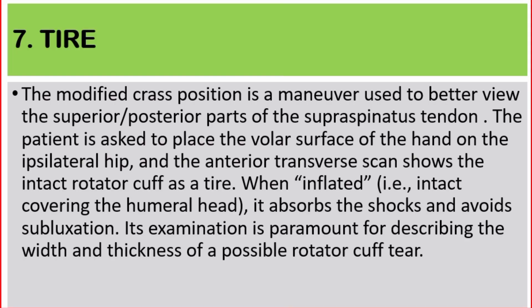Number seven: tire. The modified Crass position is a maneuver used to better view the superior and posterior parts of the supraspinatus tendon. The patient is asked to place the volar surface of the hand on the ipsilateral hip, and the anterior transverse scan shows the intact rotator cuff as a tire — when inflated, meaning intact, it covers the humeral head, absorbs shocks, and avoids subluxation. Its examination is paramount for describing the width and thickness of a possible rotator cuff tear.